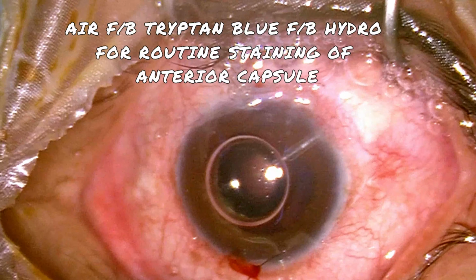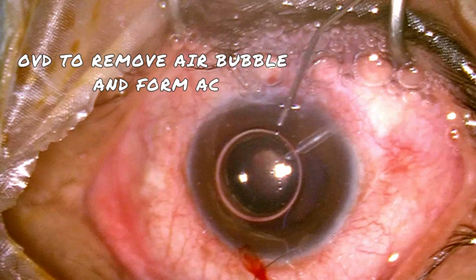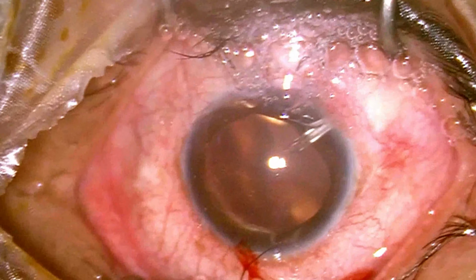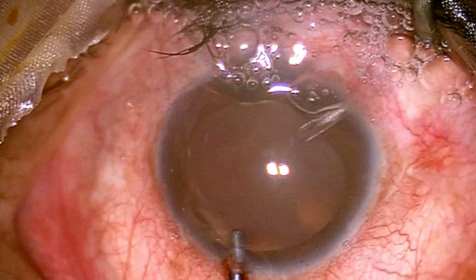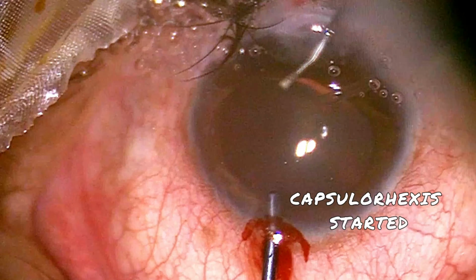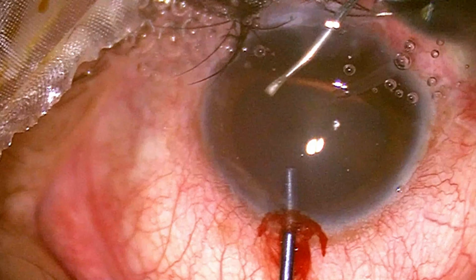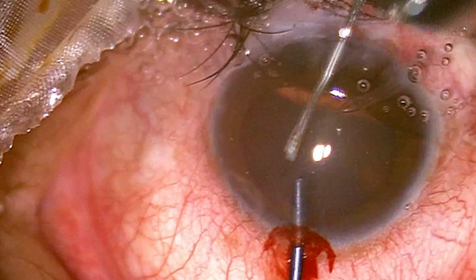After washing the dye, the recommended step is that we should use cohesive viscoelastic during the capsulorhexis. For capsulorhexis, a 26 gauge cystitome from the superior nasal side port and an iris repositor through the other side port is used to complete the anterior continuous curvilinear capsulorhexis.